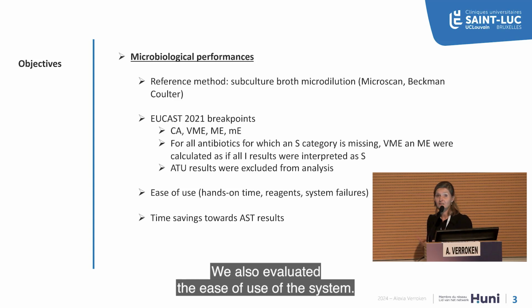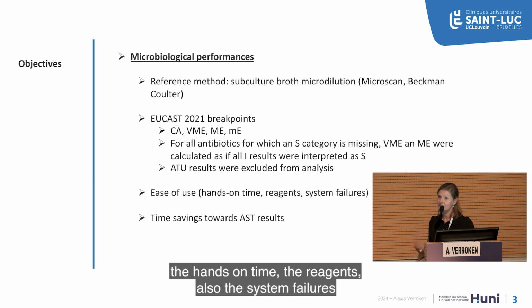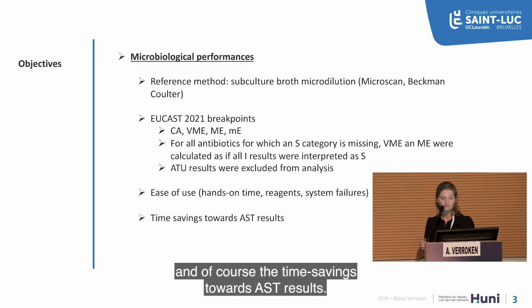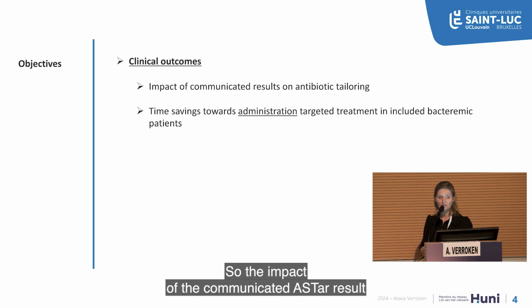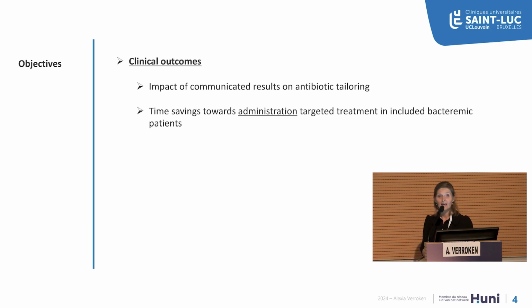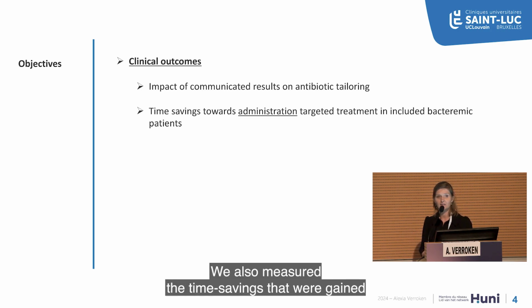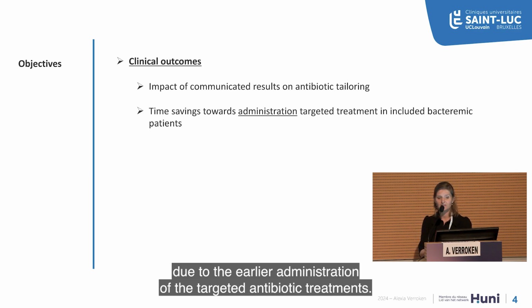We also evaluated the ease of use of the system. You will see we used the system for a little more than 6 months. We looked at the hands-on time, the reagents, also the system failures, and of course the time savings towards AST results. Then we measured the clinical outcomes, which is probably what we all want to know: the impact of the communicated ASTar result to the clinician on the antibiotic tailoring of the patients with positive blood cultures.